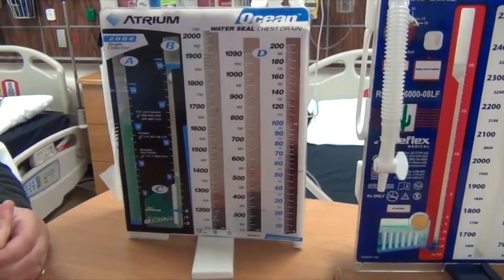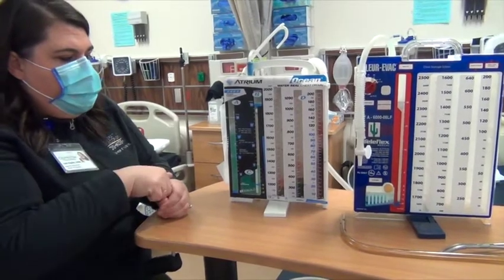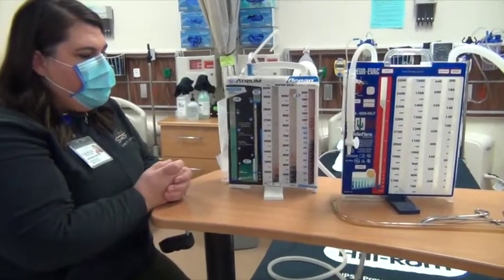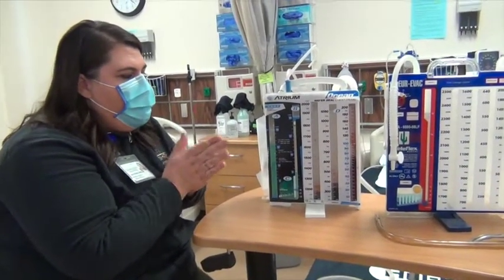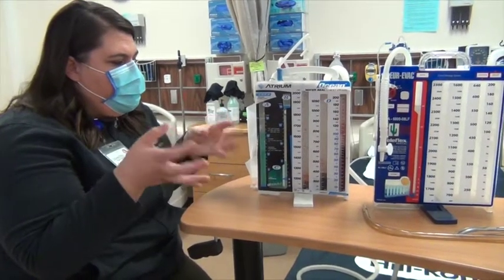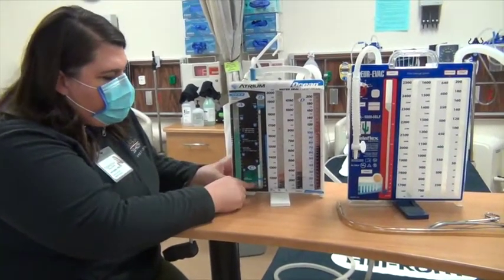Think of if you put a straw in a glass of water and you were blowing bubbles into the straw. Air can get into the glass of water, which would be this, but you can't breathe air back out through a straw. That is exactly what this is doing. It's closing that hole, letting all the air and fluid get out that shouldn't be in there, and not letting any new air in, so that the lungs can re-inflate and they're no longer collapsed. It's like your straw in the glass of water.